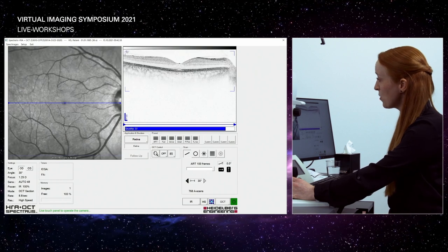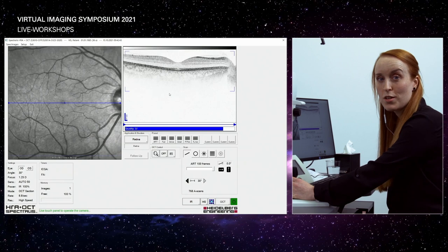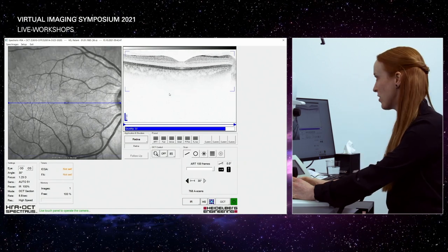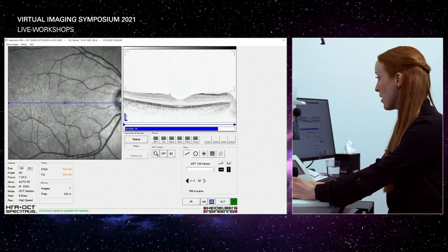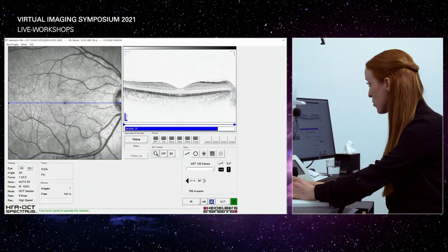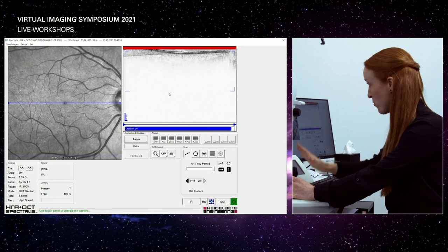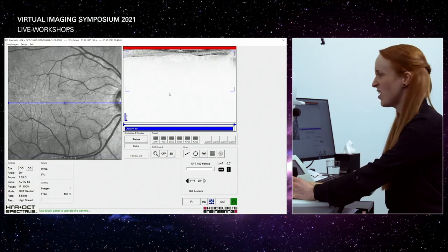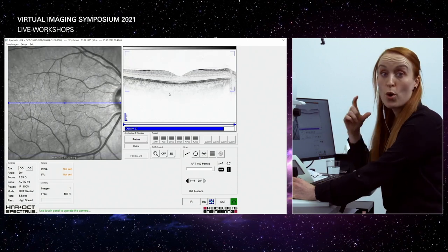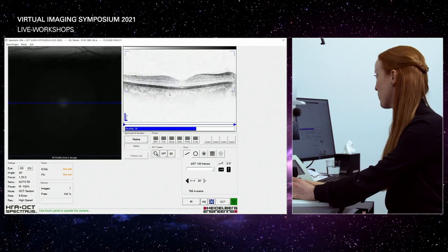You can see those four blue brackets in the upper half of the window. If you want to do it perfectly, you have to place your OCT right there. If you're too far away, maybe there will be some additional noise in the picture. If you're moving too close to your patient, so I move the camera towards the patient now, then maybe some structures are cut off. So what we want to do is image the whole retina, okay? Therefore it has to be there in this window, okay?